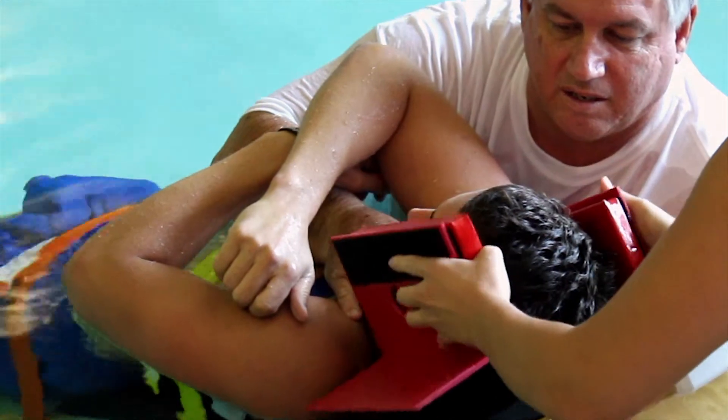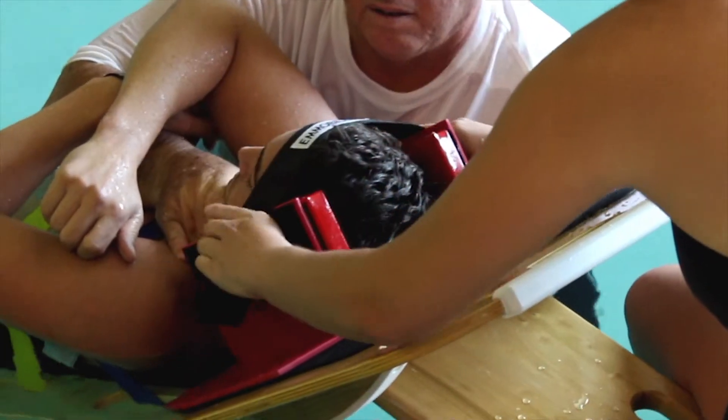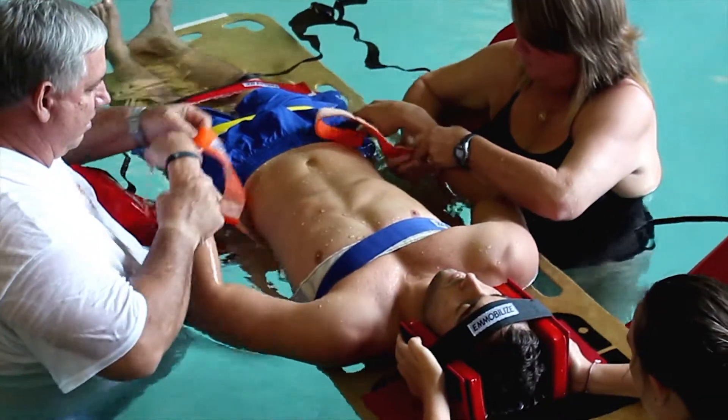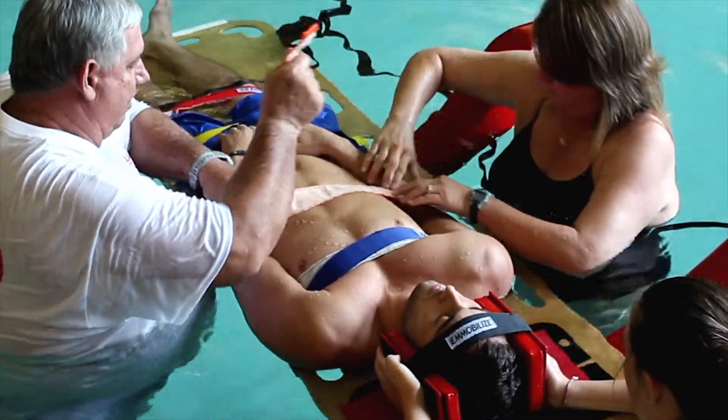Each unit comes complete with a unique one-of-a-kind Emmobilize head immobilizer kit, which is the longest lasting head immobilizer of its kind available on the market today.